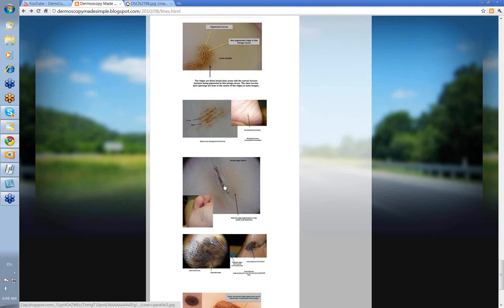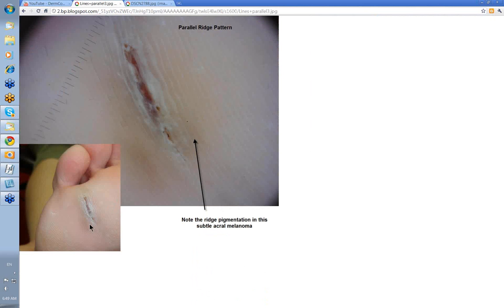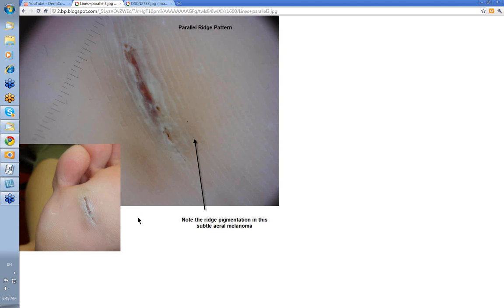This was a subtle one on the sole of the foot where some paring had been done by a podiatrist. Look at the areas of pigmentation — these thick broad areas are pigmentation in the ridges, and the white areas are the furrows. The subtle thick pigmentation is in the ridges with the clear white furrows in between. This was an acral acral melanoma — an invasive one — showing a parallel ridge pattern with thickened pigmented ridges and white furrows in between.